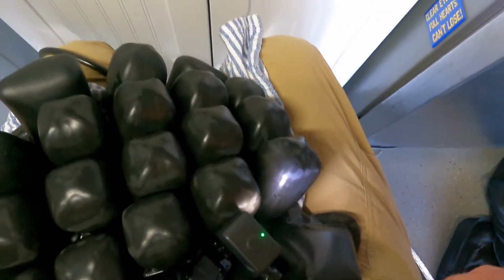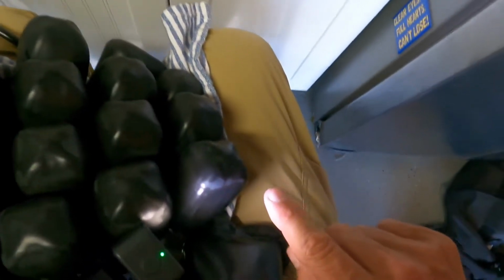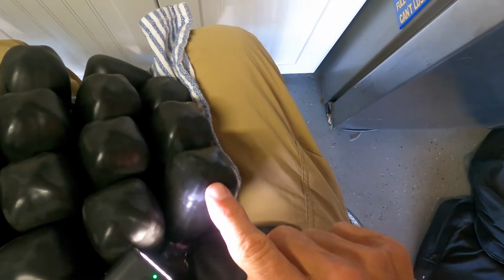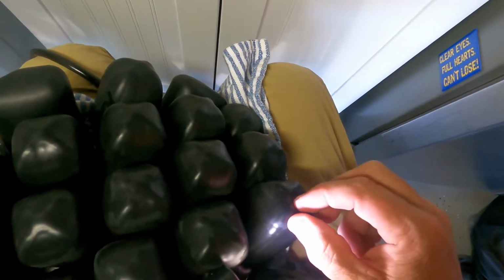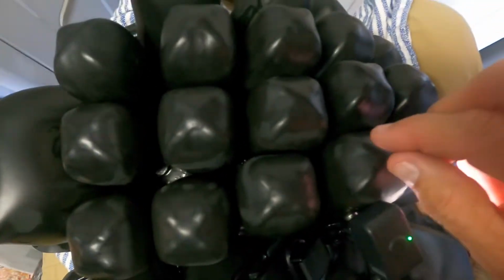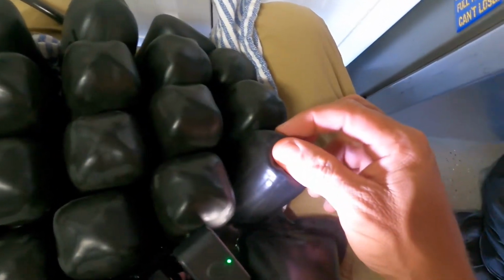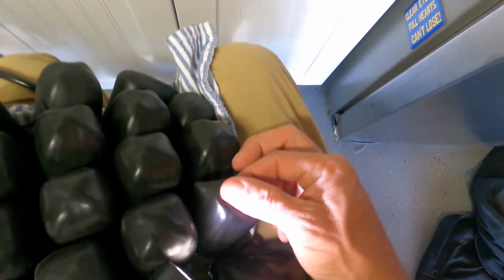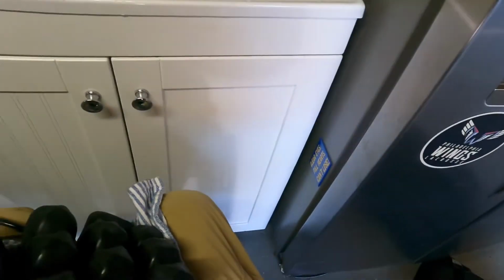What I do to patch this is make sure it's real dry, obviously. You can see here where the rubber starts to wear over time. See the different color? That's just the rubber getting a little thin in some of these different places. You can see where it's kind of discolored. But let's fix this.